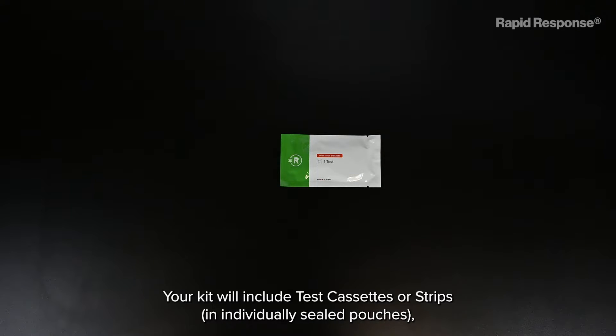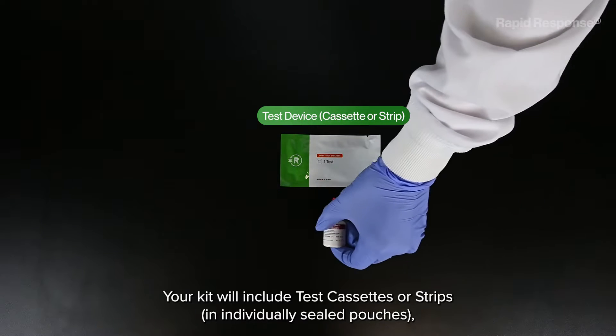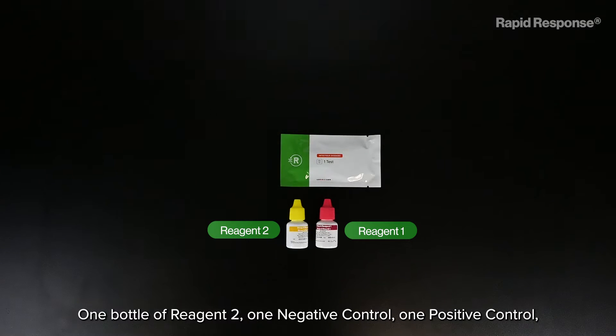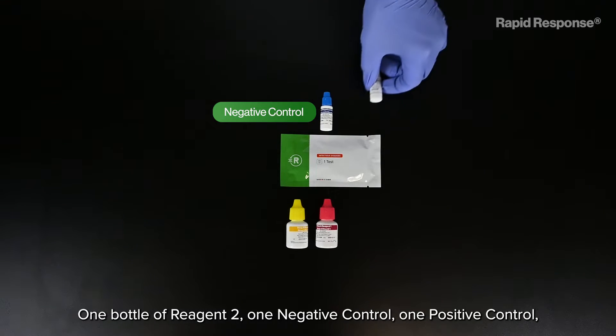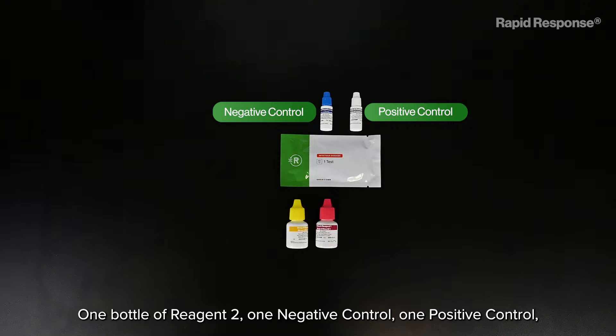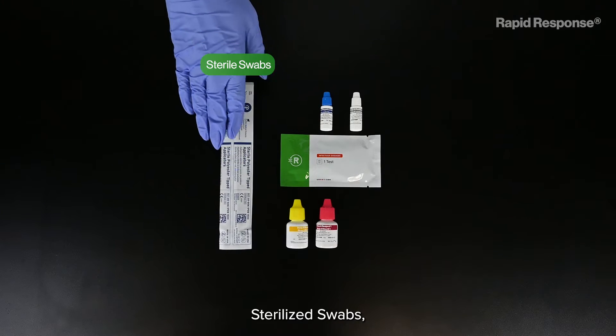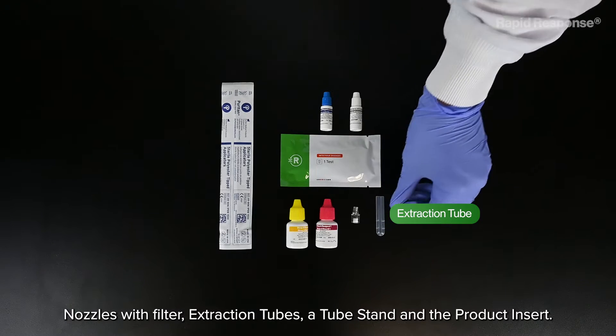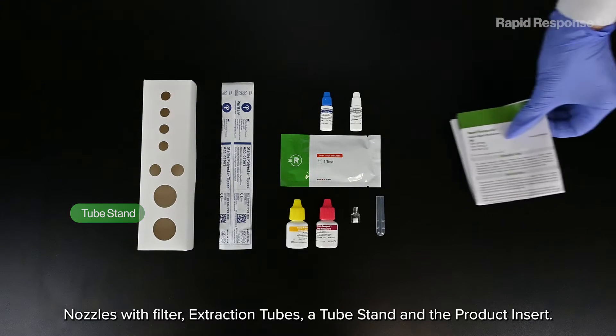Your kit will include test cassettes or strips in individually sealed pouches, one bottle of Reagent 1, one bottle of Reagent 2, one negative control, one positive control, sterilized swabs, nozzles with filter, extraction tubes, a tube stand, and the product insert.